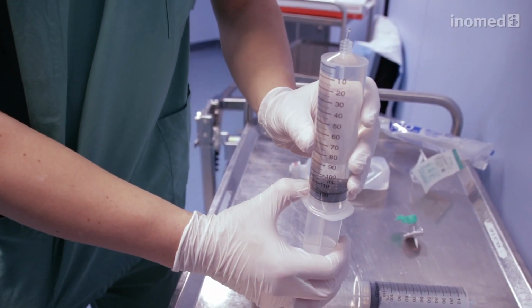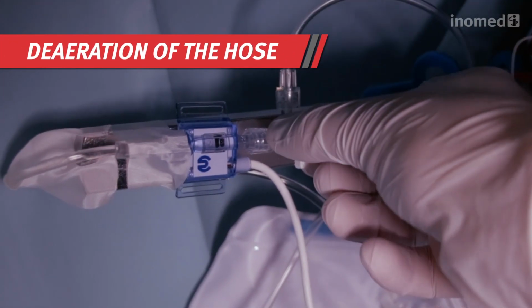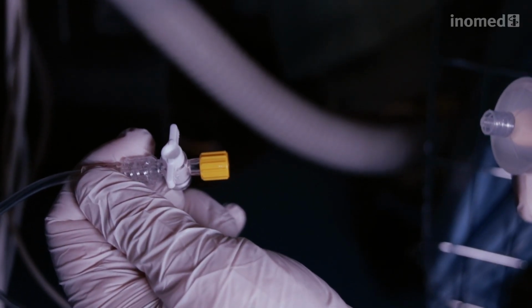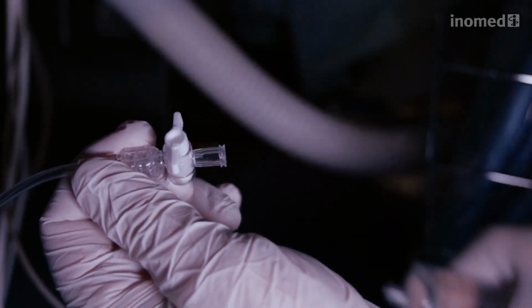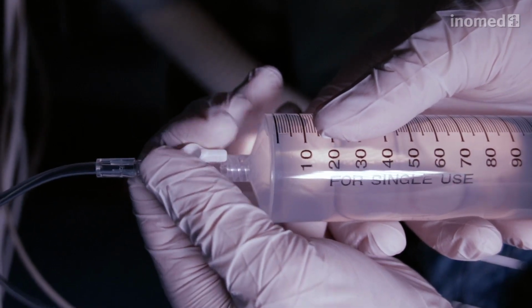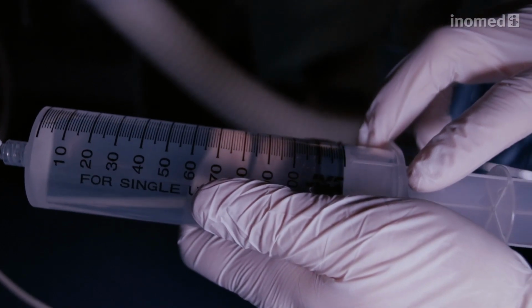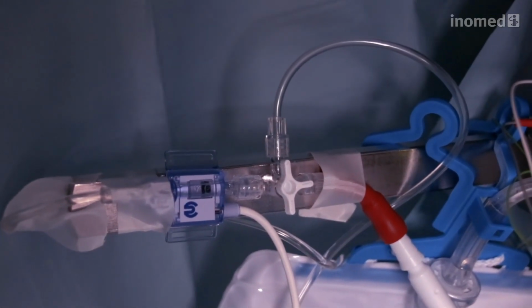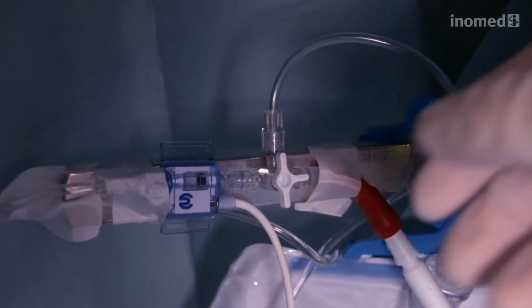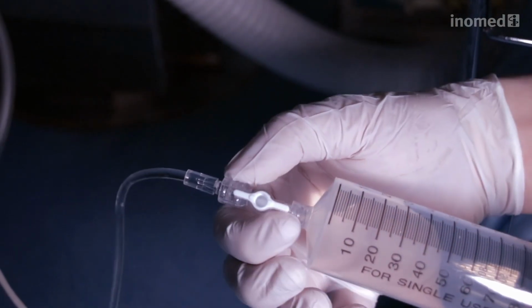The three-way valve is turned in order to link the syringe to the urine bag while closing the catheter direction. The syringe is connected to the system and the valve is opened. The hose has to be filled now in order to remove all the air, since air would distort the measurement. Afterwards, the three-way valve can be turned again to link the bladder to the urine bag in order to ensure urine flow during the operation. The syringe valve can now be closed again.